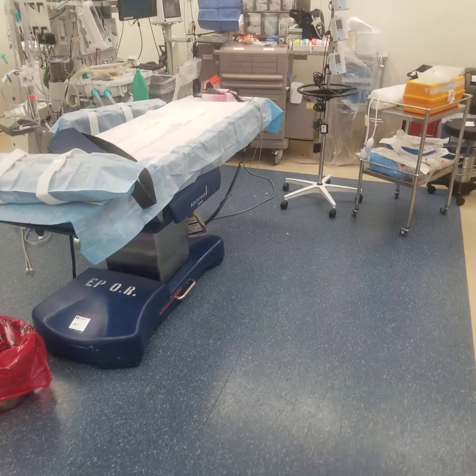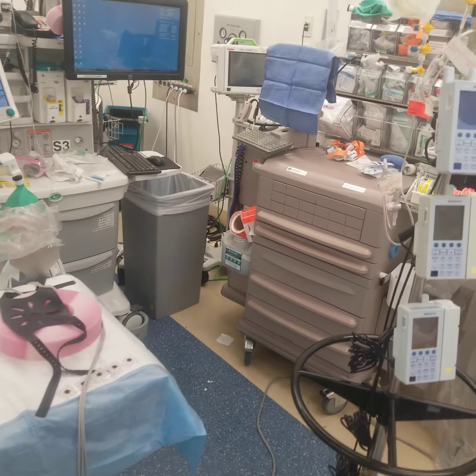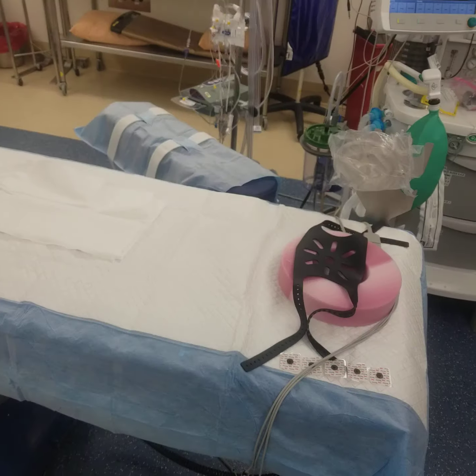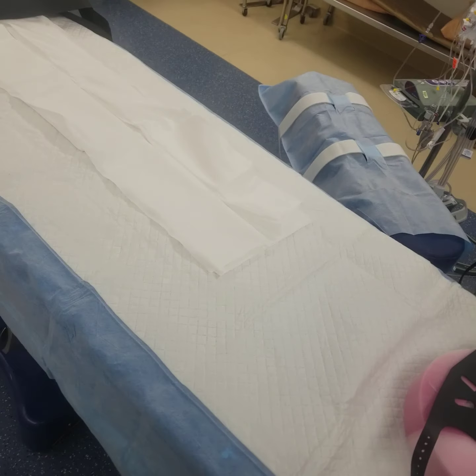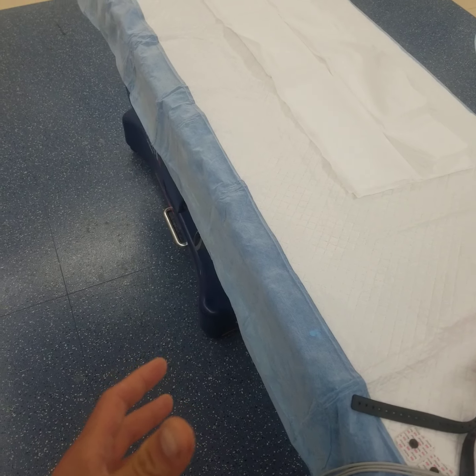Okay, so you're rolling the patient in right now. You're by yourself, let's say, or you're with the preceptor and you really want to impress them. So when you bring the patient in, roll the bed up to the side here, drop the railing, lock the bed where the head right here is matched up with your head, so you won't have to move the patient twice, okay?